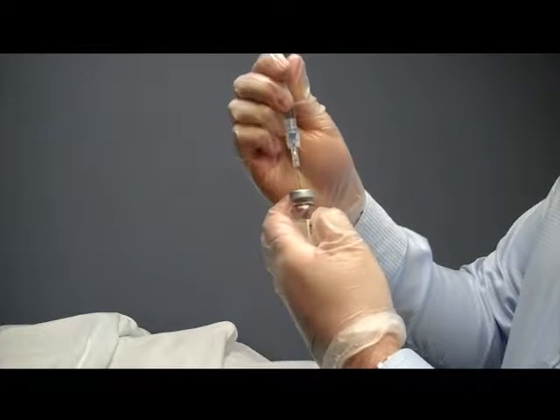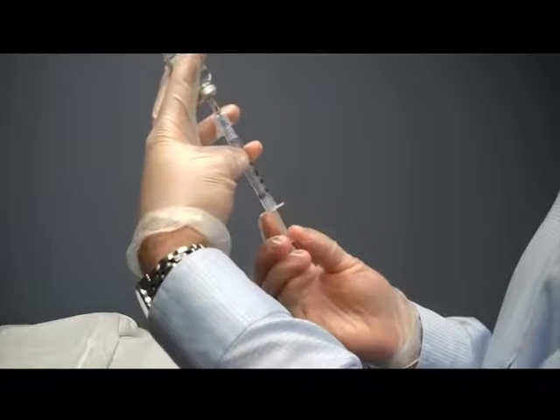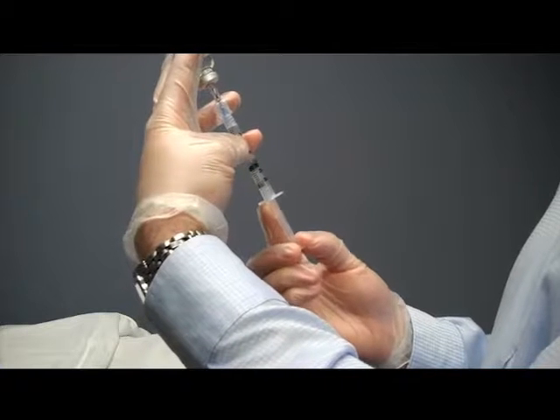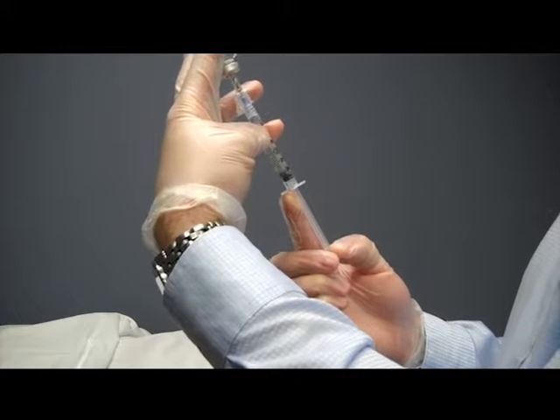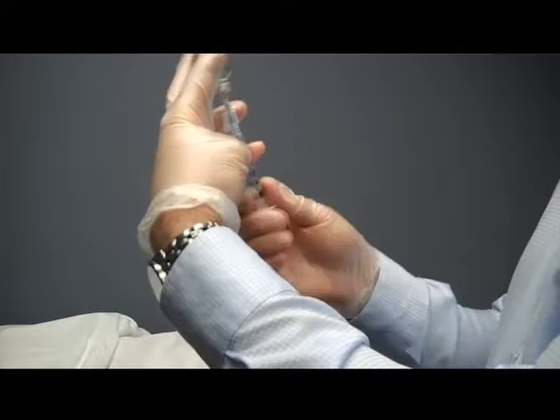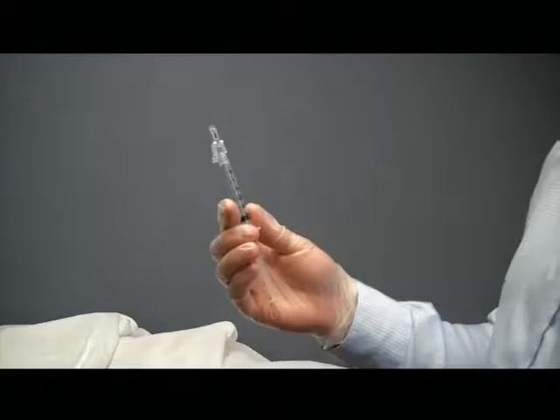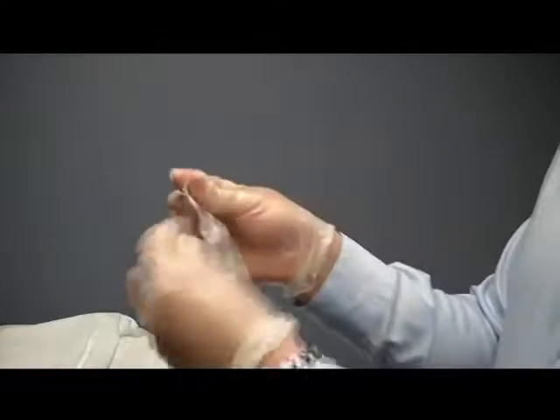We have determined the patient requires Narcan in order to reverse their depressed respirations and have decided to administer it by the intranasal route. We will now want to assemble the medication and the mucosal atomization device. The atomizer screws onto the end of the Narcan syringe like this.